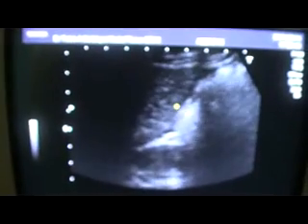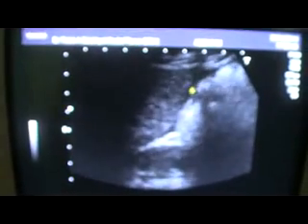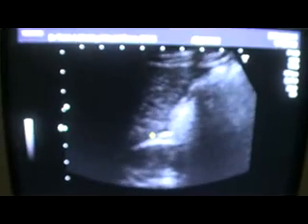Now this is the fluid — we call it fluid in the hepatorenal angle of Morrison's pouch. This is the fluid where I am moving the cursor. This is a thin layer, a very small amount of fluid.